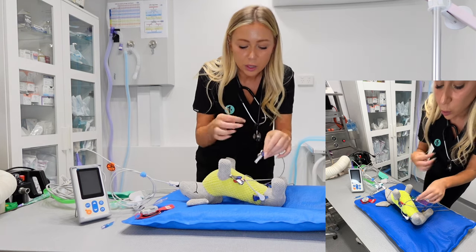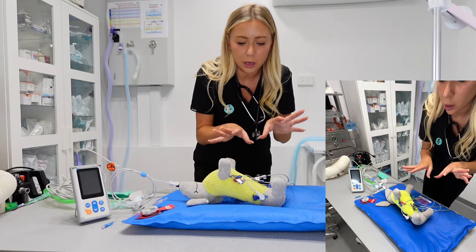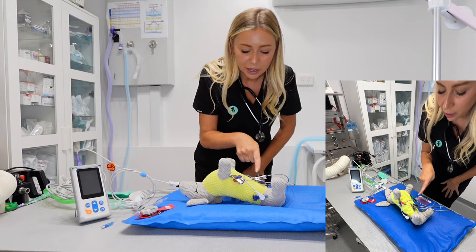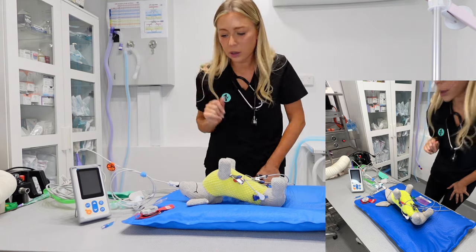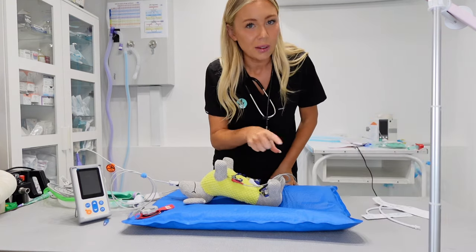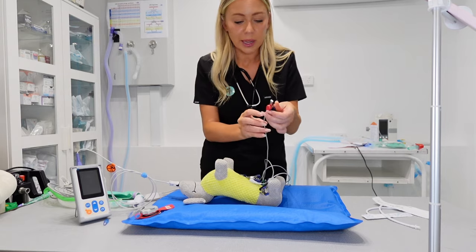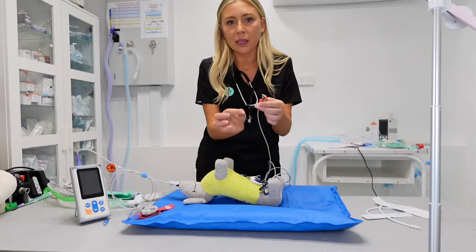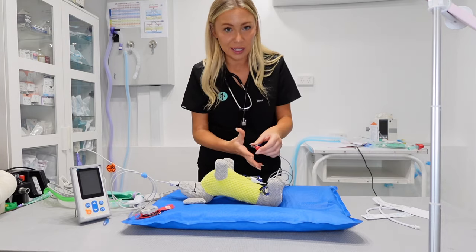The main thing with attaching the ECG leads is just making sure that you're covering the four quadrants of the heart — right up in the right forearm area. Make sure that the sensors are connected to your clips well, because sometimes they slip off a little and that won't give you a good reading. With the centre lead, you want it right over the sternum. I've also seen clinics use a label maker to put little tabs on the ECG cords — labels saying LL, right L, centre — making it so much easier.